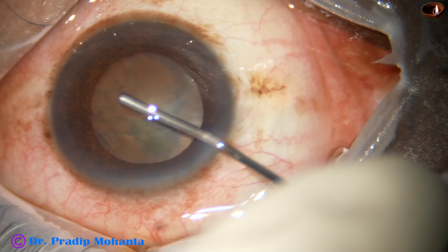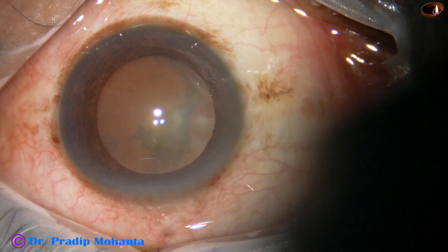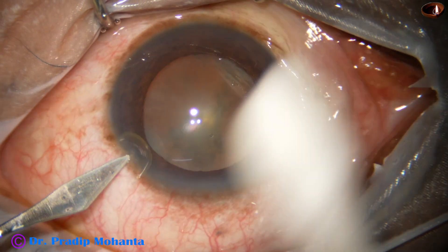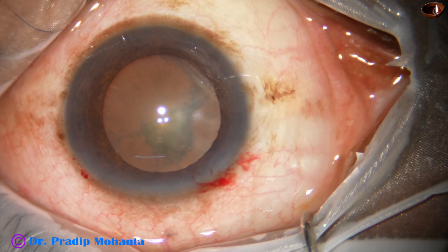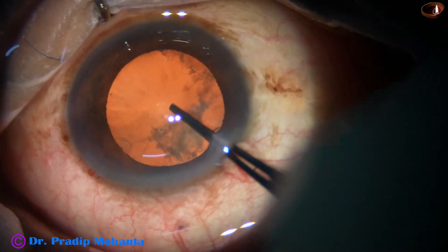The anterior chamber is filled up with 2 percent hydroxypropylmethylcellulose. A side port is made on the left side of the main incision about 3 clock hours away. And now capsulorhexis is being done.